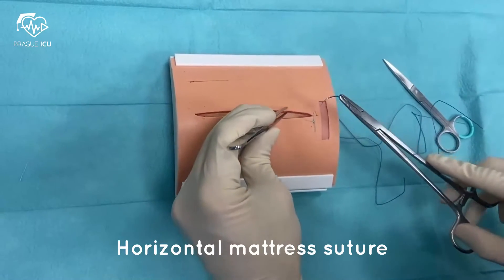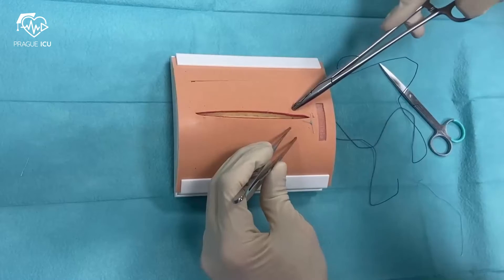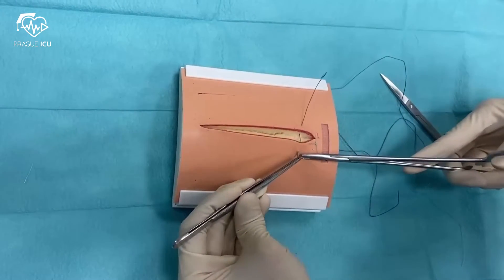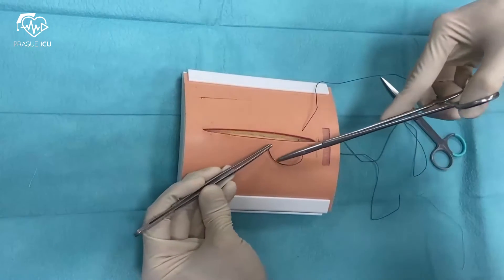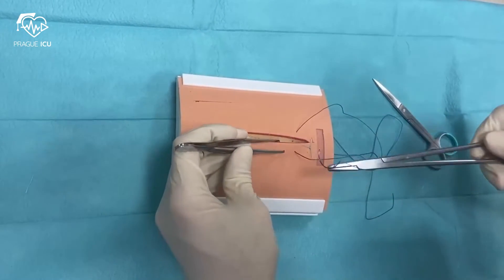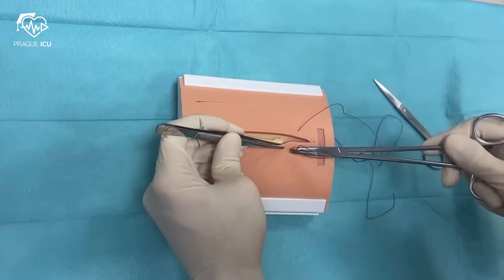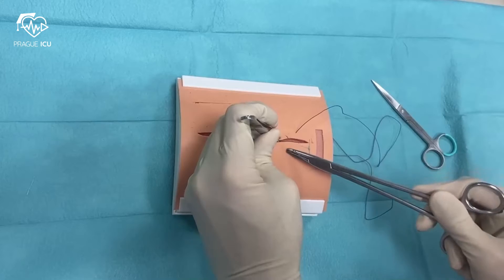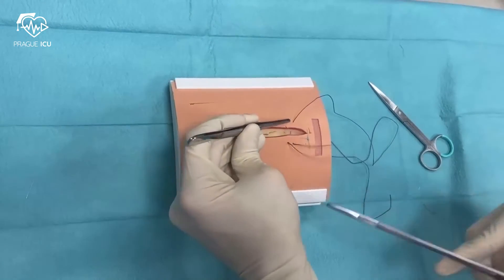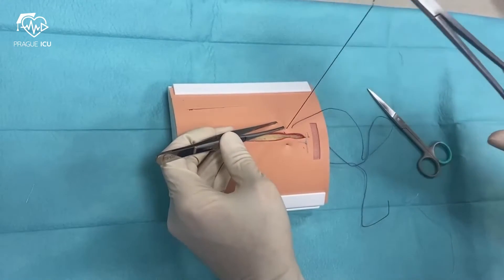The second one is horizontal mattress stitch or U-stitch. It starts from one side, crosses to the other side. Then reinsert the needle at a small distance from where it emerged and take it through to emerge on the original side a short distance from the first entry.